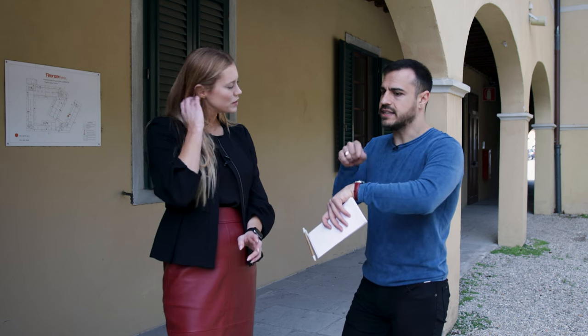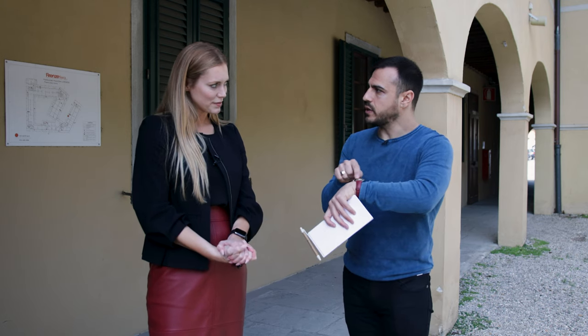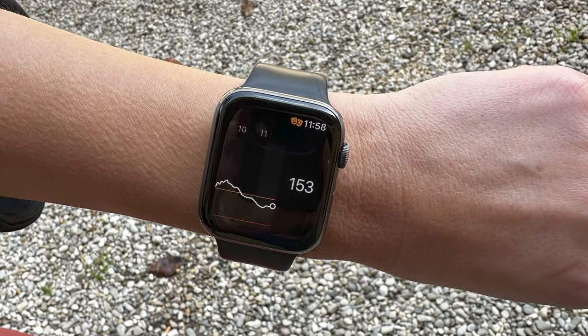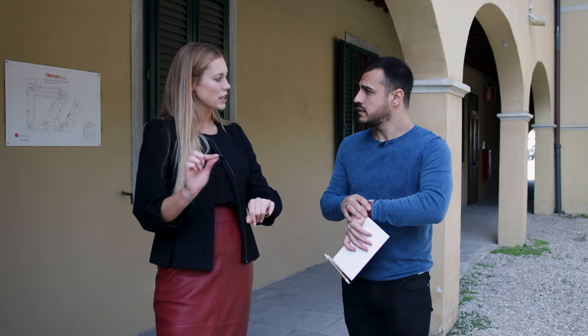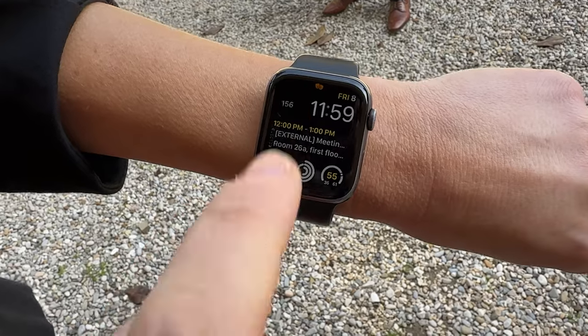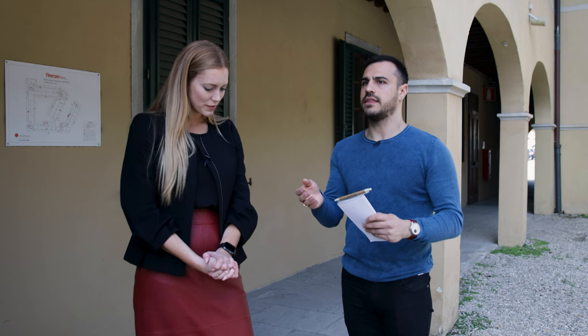There is an actual Apple Watch app showing the sensor glucose tracing, logged events, and trend arrow. There is also a watch face complication available for Simplera. When it comes to alert customization, you can adjust when alerts are triggered — either through the Simplera app or the InPen app depending on the alert type.